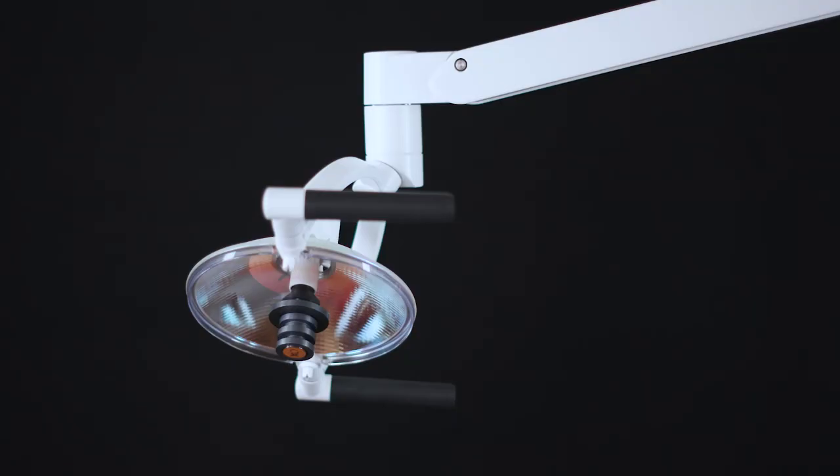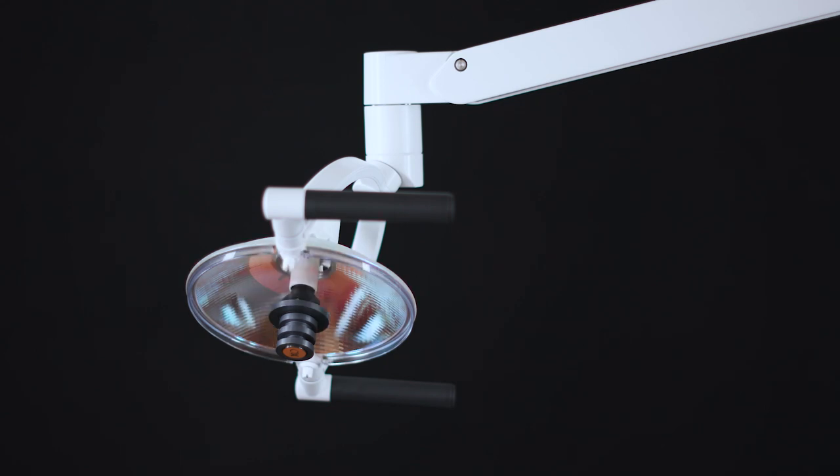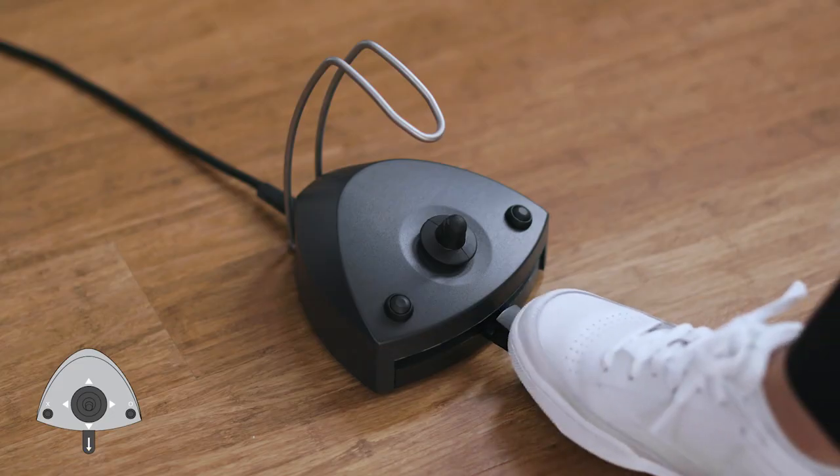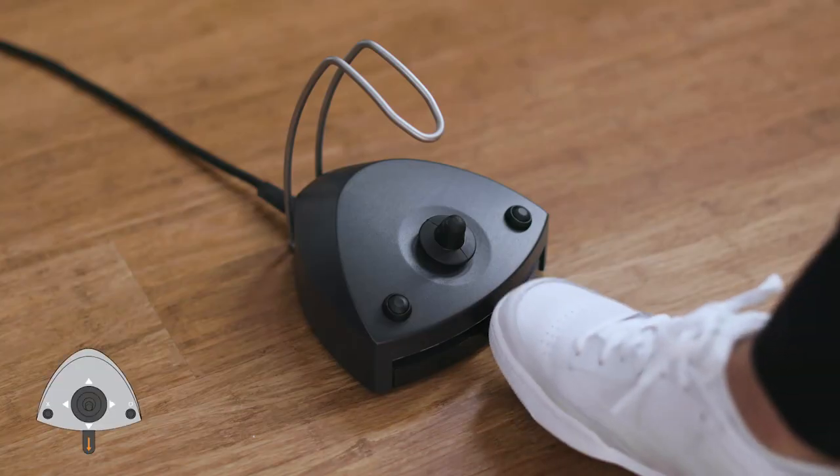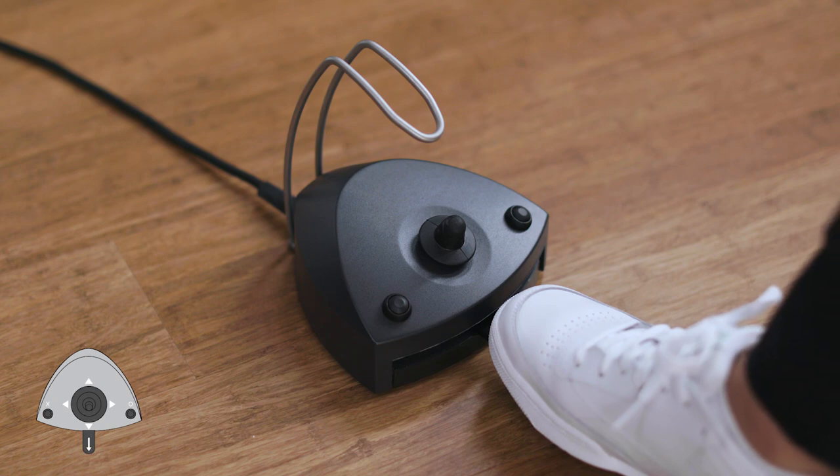Optionally, you may configure the operating light to be switched on and off using the foot control while the instruments rest. Switch the light on and off by pressing the pedal down shortly. You change light intensity by holding the pedal down.